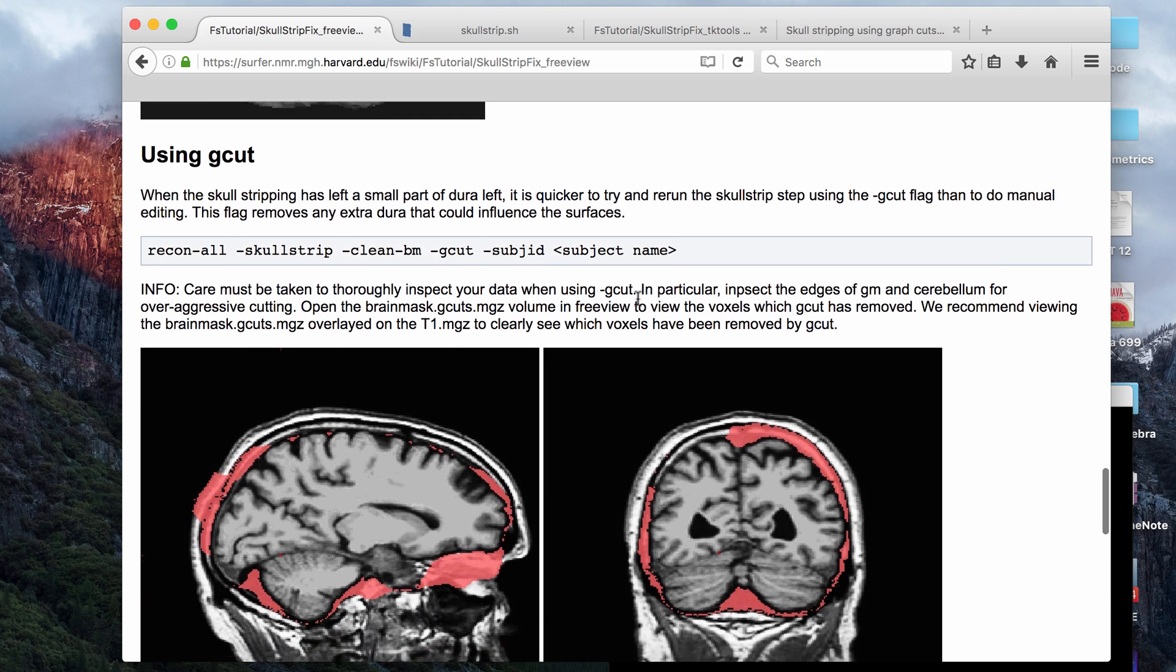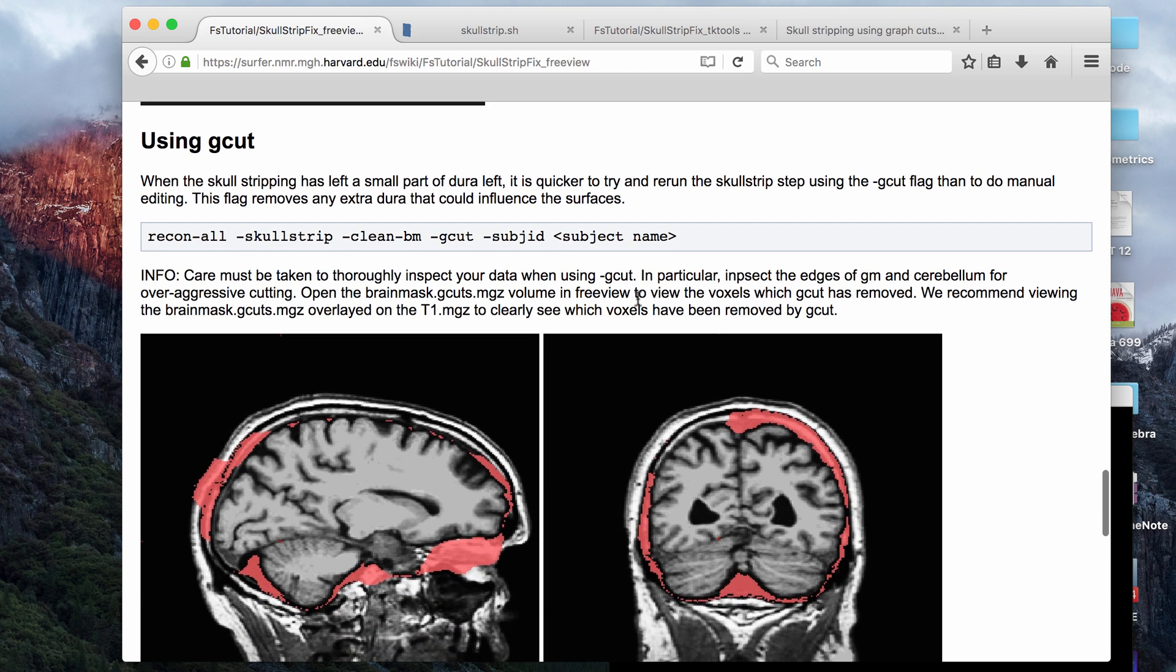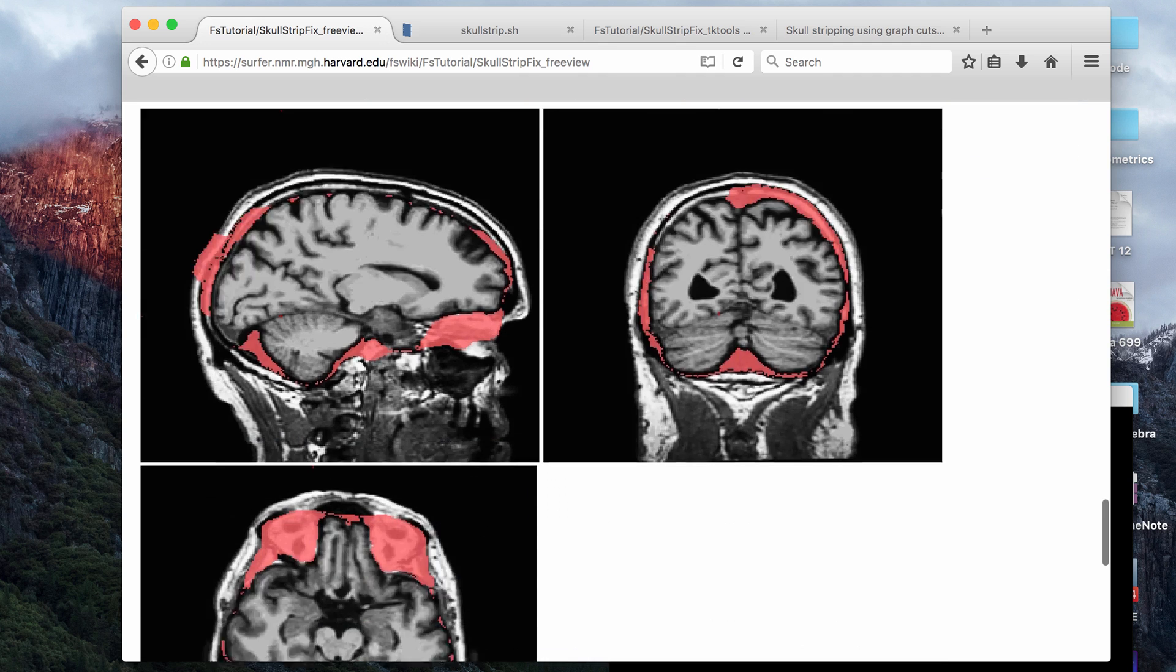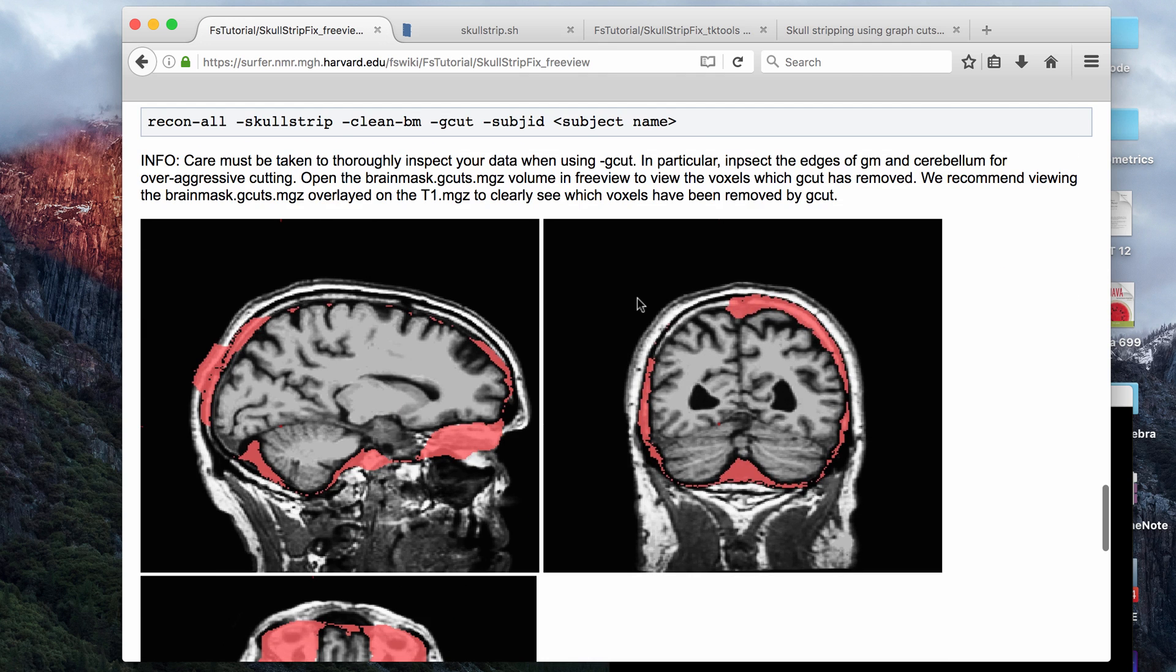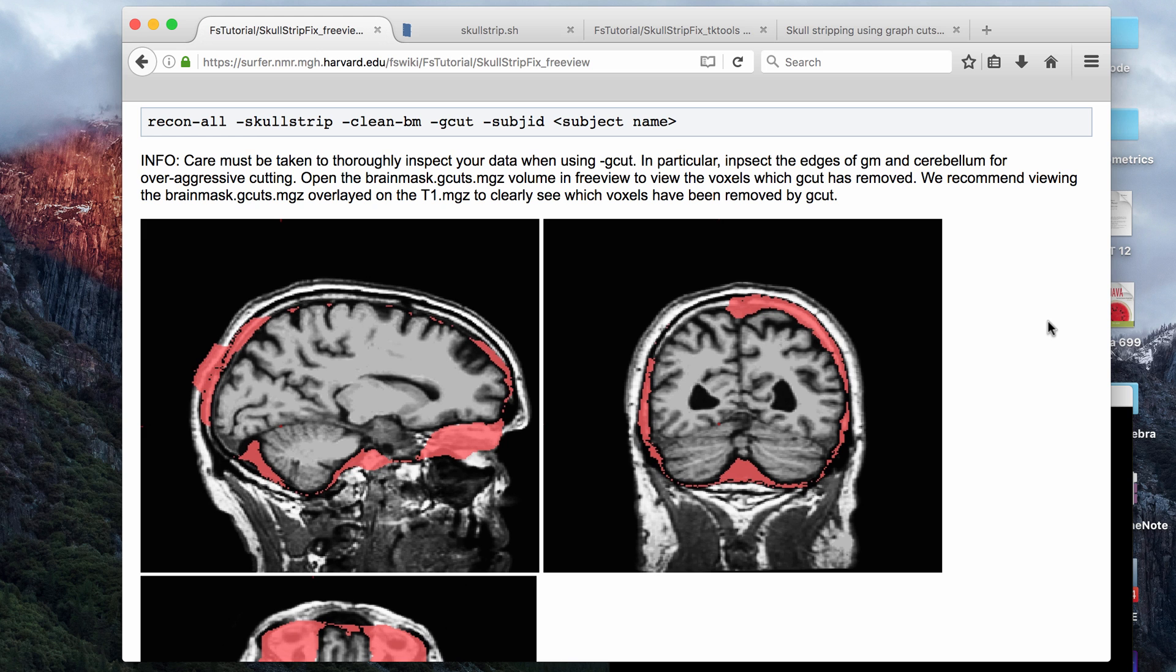Now the reason gcut is not part of the automatically run commands in the auto recon stream is that it sometimes has a tendency of being overly aggressive, so every time you run the gcut command, it'll give you a little warning text that tells you that part of the brain might have been cut out when you used gcut.